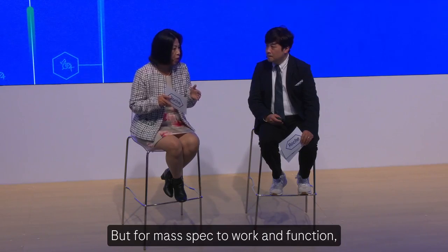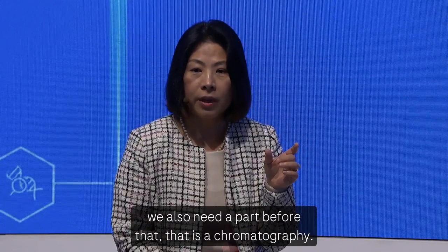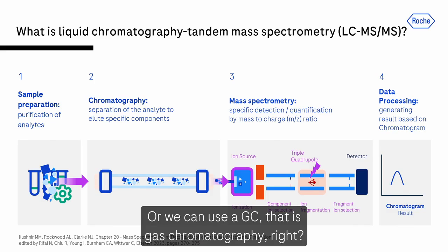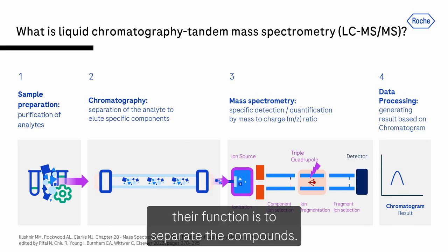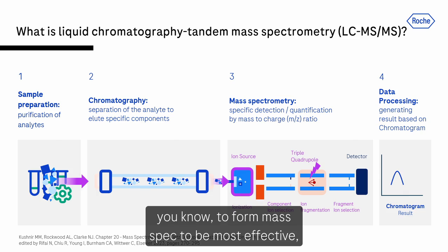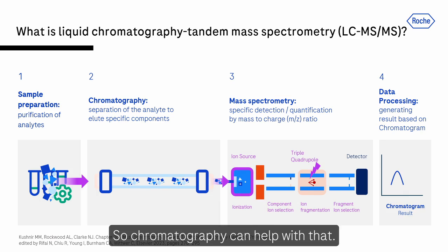But for mass spec to work and function, we also need a part before that, which is chromatography. When people see LC mass spec, that is liquid chromatography, or we can use GC, gas chromatography, for GC mass spec. The function of chromatography is to separate the compounds. Think about body fluids: we have a lot of things in blood. For mass spec to be most effective, we have to separate them. You don't want to just shoot everything inside, so chromatography can help with that.